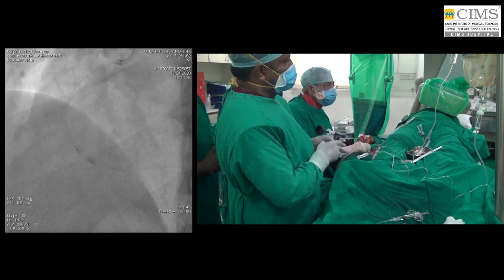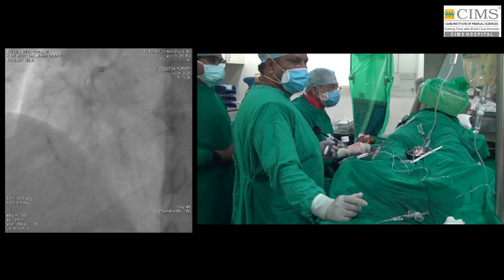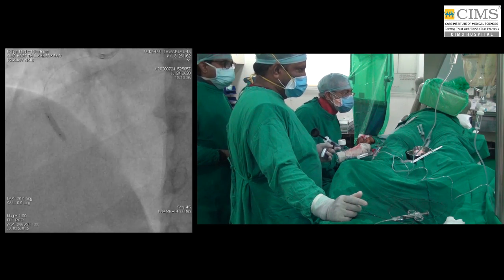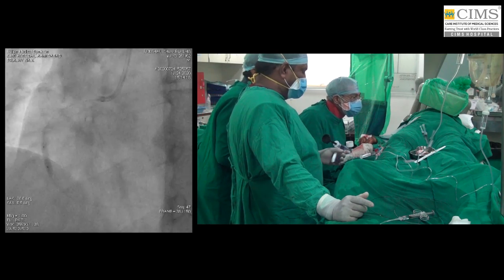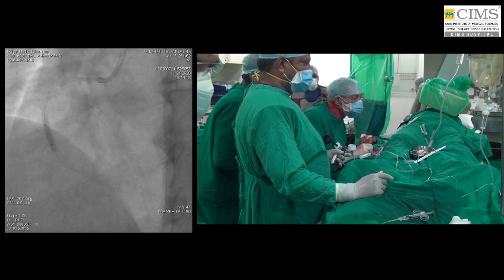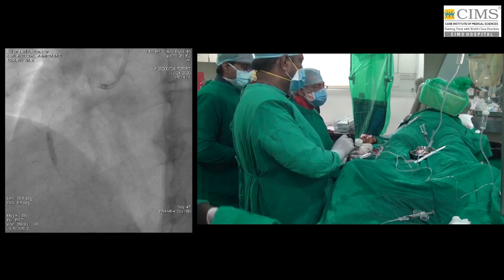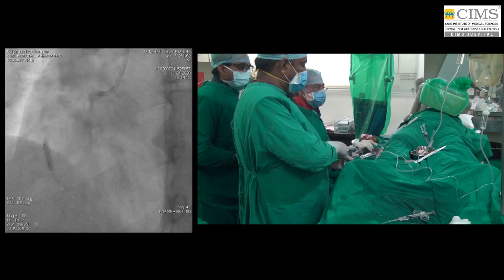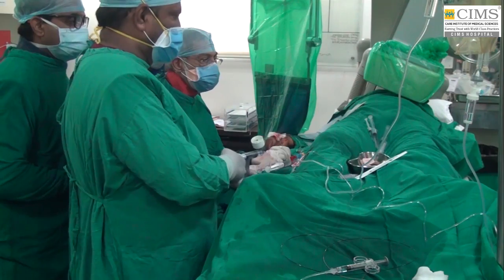So, Dr. Keyur, I want to ask one question. How has an OCT after a stent implantation helped you? Means, what is the difference between a pre-OCT era and this OCT era in implanting a stent? It is like day and night. In the pre-OCT era, it was all experience and judgment, and very likely the outcomes may not have changed as much, but the quality and the precision with which we do our cases has significantly become better.